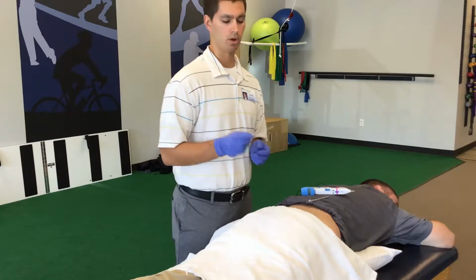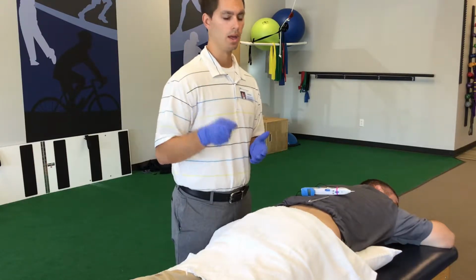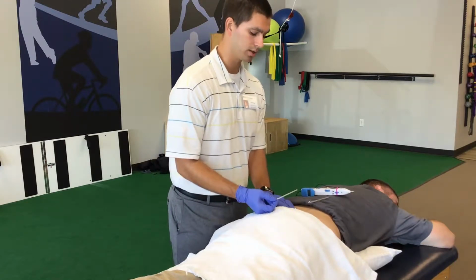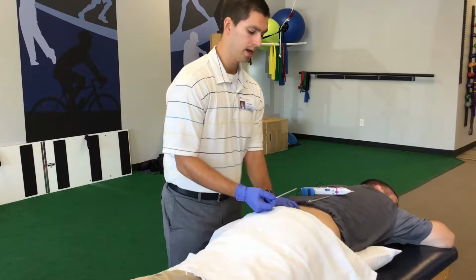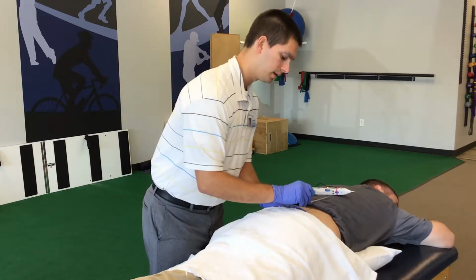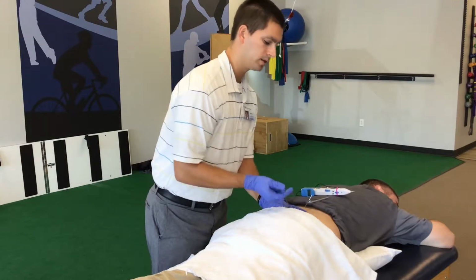The needle is very small, and this is just a guide wire. You can't even see the needle here. But what we do is we find the spinous process here. So this is Josh's L5 spinous process, and we go about 1/4 to a 1/2 inch off to the side, and I let him know, Josh, you're going to feel a little bit of a tap here. And so that's usually the worst part.